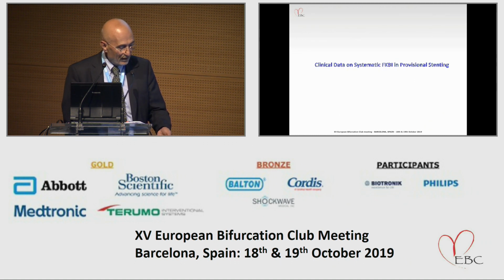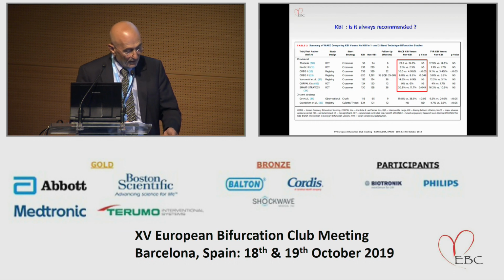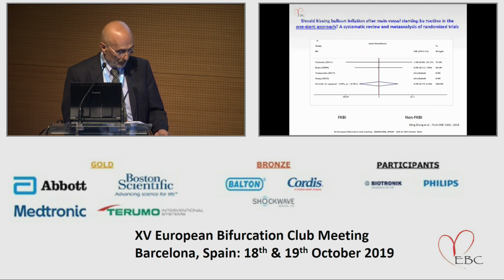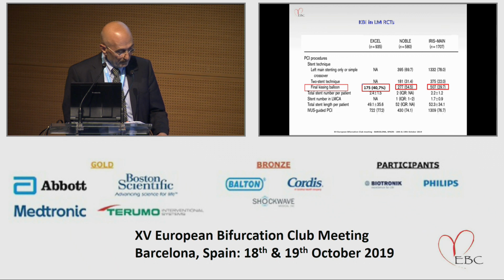Clinical data on systematic final kissing balloon inflation, whether or not followed by POT, show that if you focus on MACE, kissing balloon inflation is associated with more MACE than non-kissing balloon inflation. This is also confirmed by other meta-analyses, also in left main randomized clinical trials.